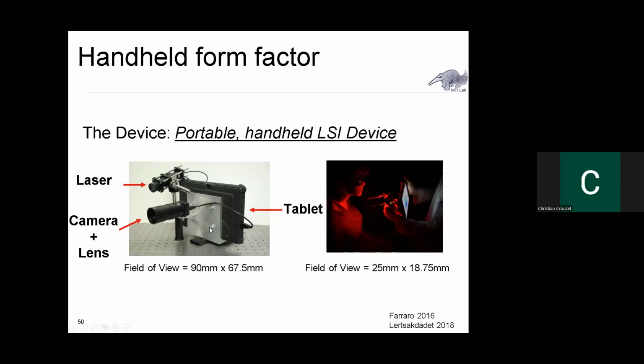And this was basically the whole device. So you can just hold it, it'll be able to acquire the data for you and have a decent sized field of view in this handheld format.